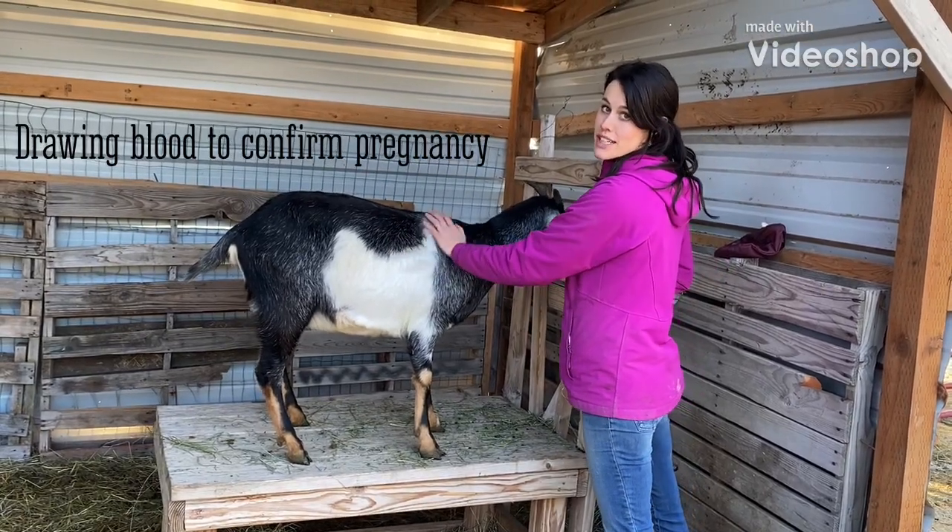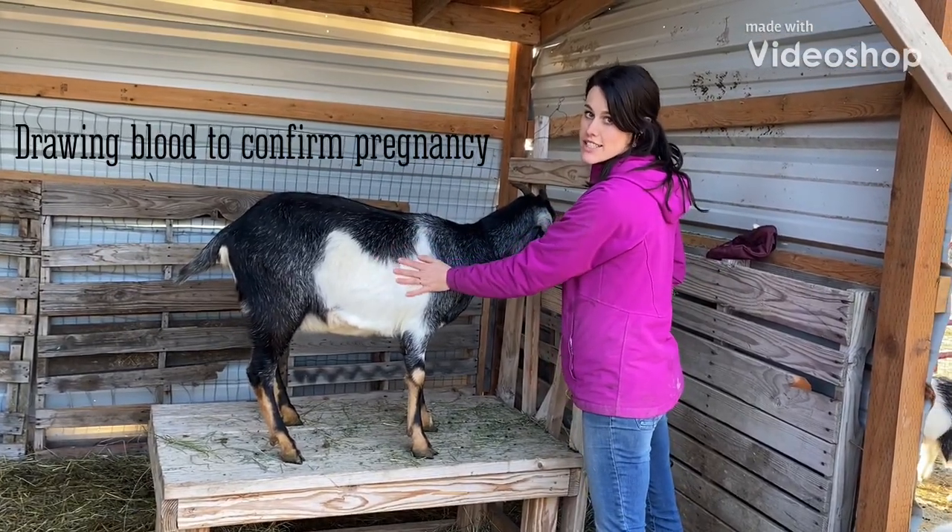We are drawing blood on Sophia to find out if she is pregnant. I'm going to send it in to Sage Ag Lab.